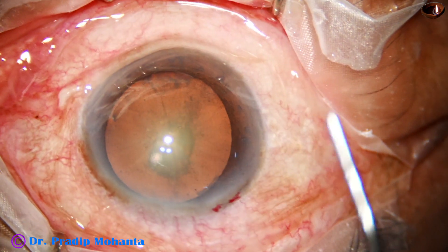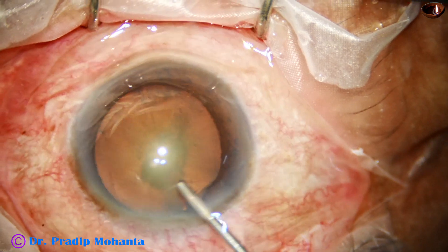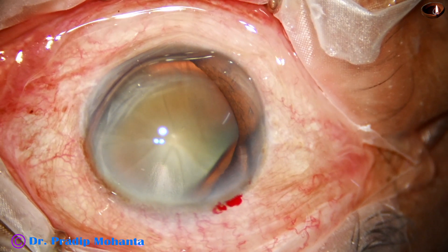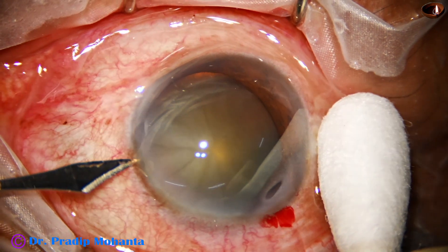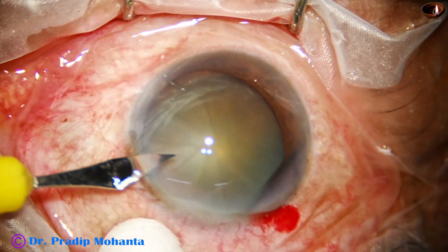We can see some oozing of blood, and this is good because healing is much better if we give the incision at a place where there are some blood vessels. And now, this is a side port on the left side of the main incision, about 3 o'clock hours away.